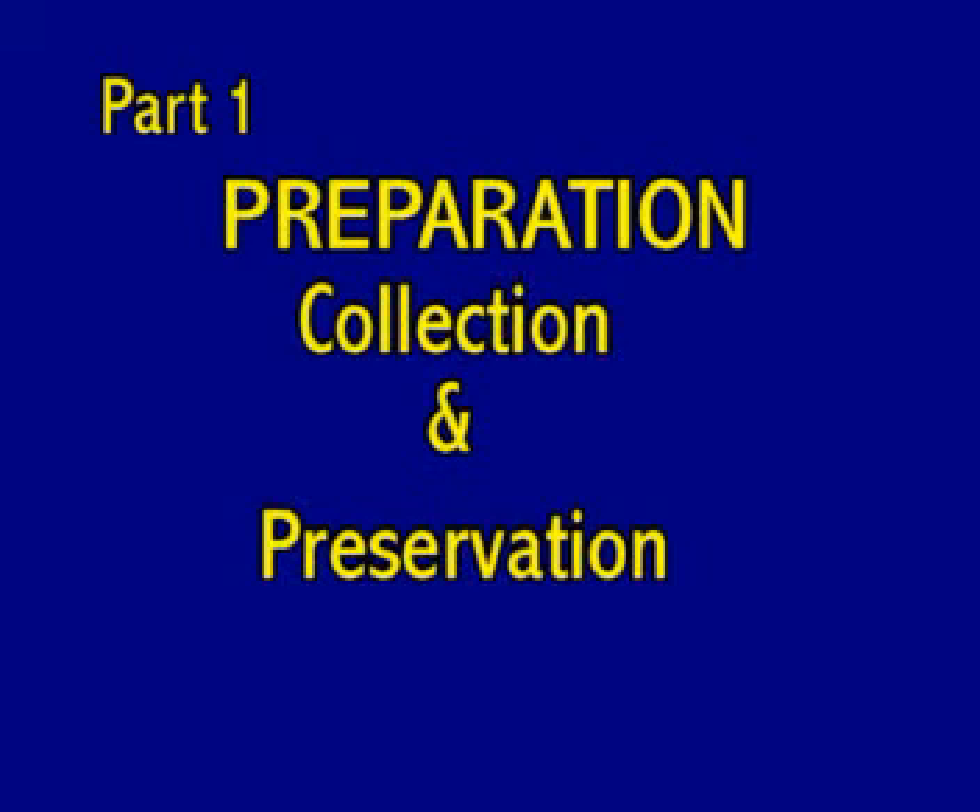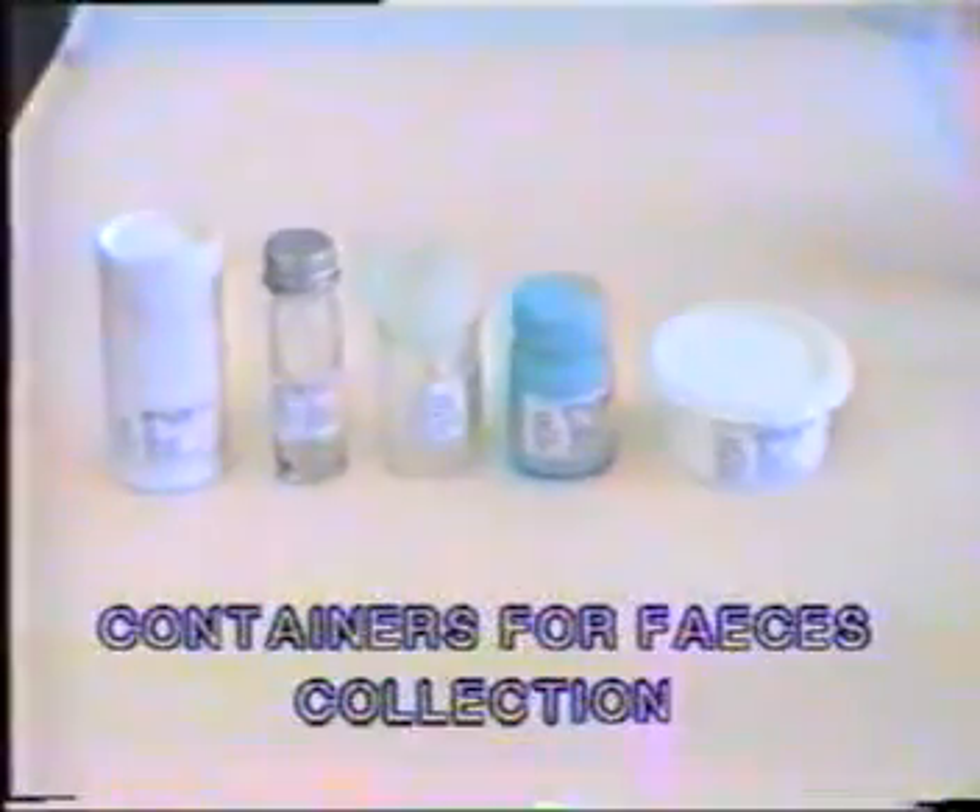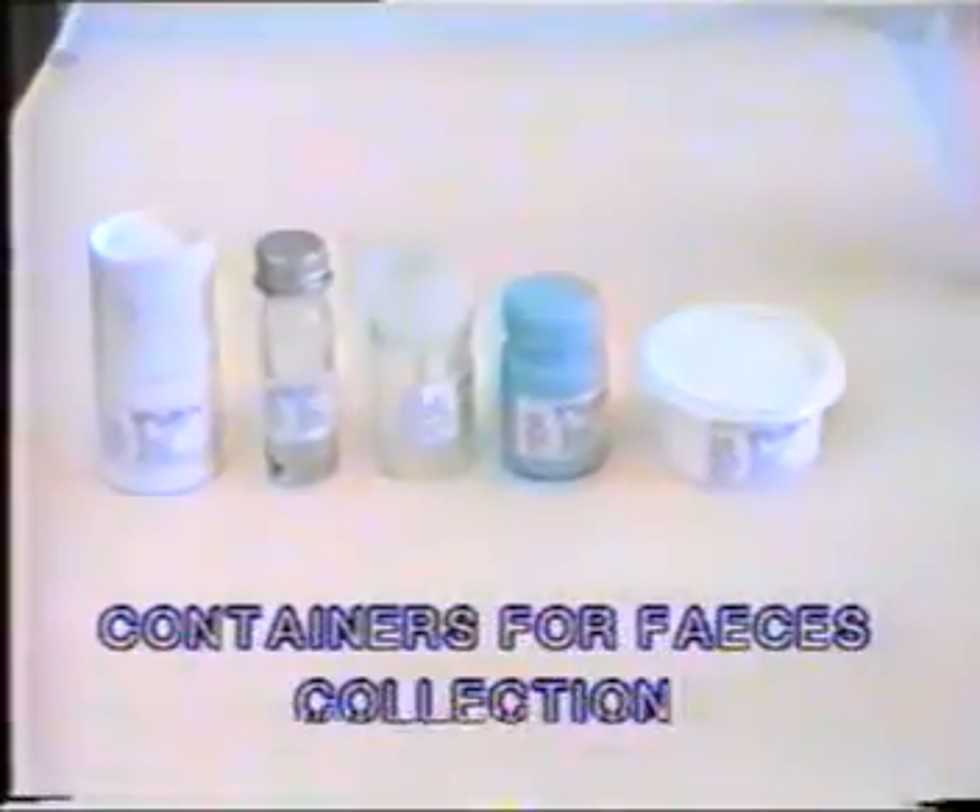For any examination procedure, the proper collection of specimens is vital. The containers could be of glass, plastic, or wax paper. They should be either disposable or sterilizable. Containers such as these, which are usually given to hospital patients for faeces collection, should never be used.